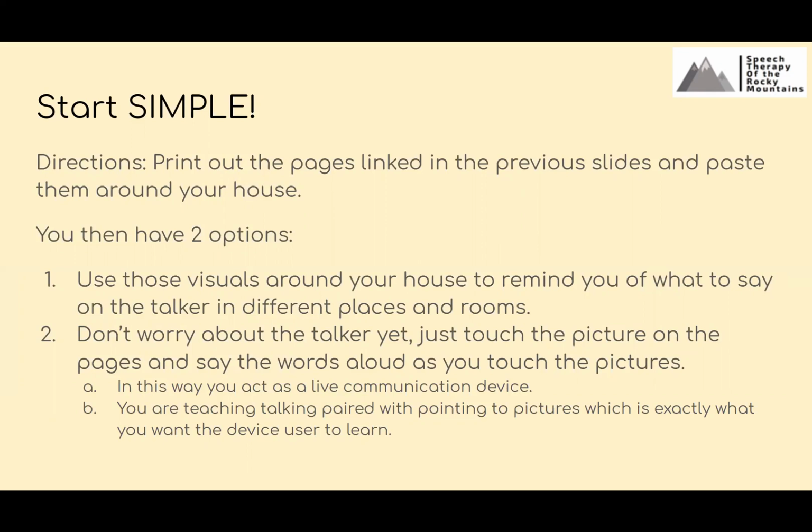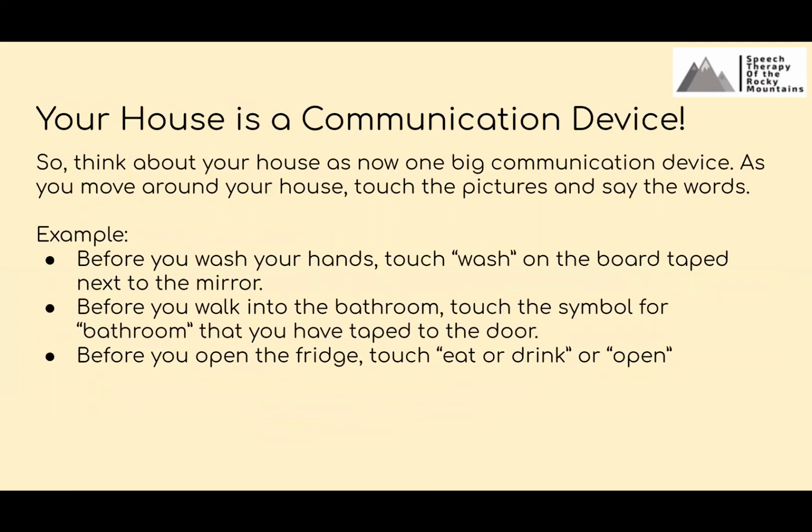So you're acting as a live communication device, and you are teaching, talking, paired with pointing to pictures, which is what you want the device user to learn and to see you modeling. So your house becomes a communication device. Hopefully this is pretty straightforward and easy to understand.